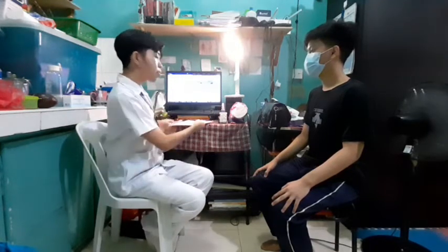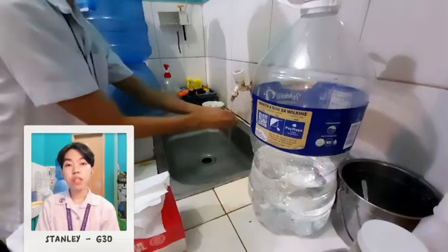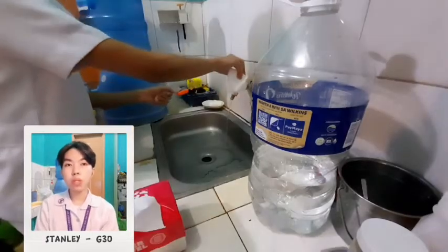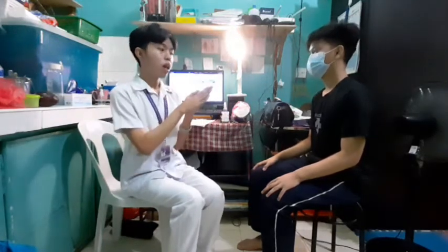I will perform hand hygiene before conducting the assessment. I'm done with my medical hand washing and drying my hands. The purpose is to prevent any spreading of microorganisms or infectious diseases from my patient to my surroundings.